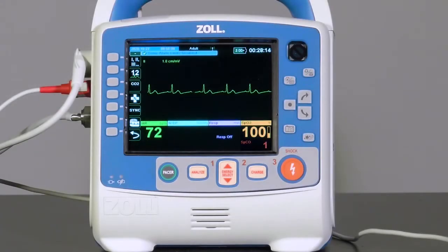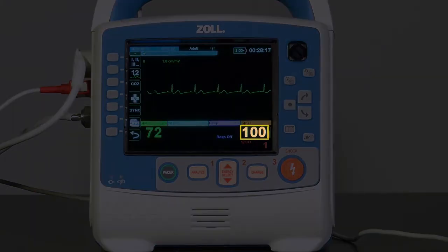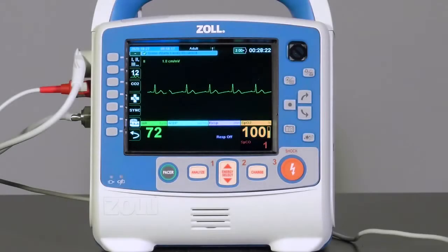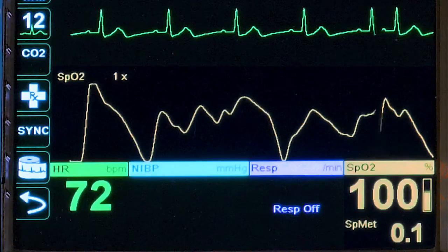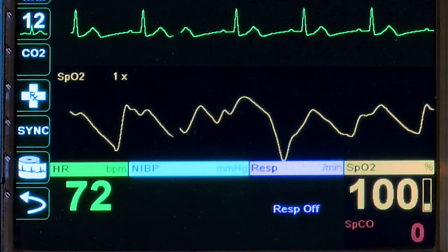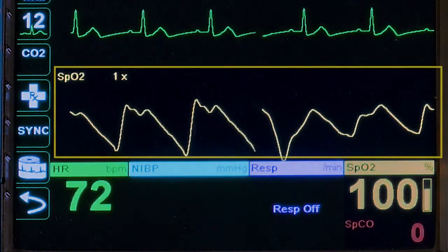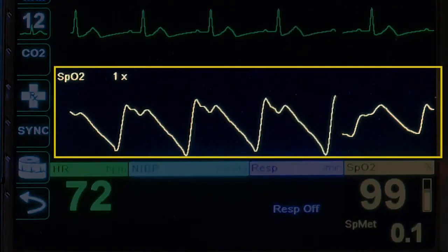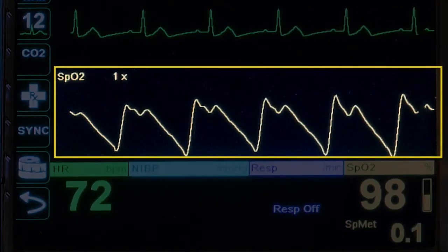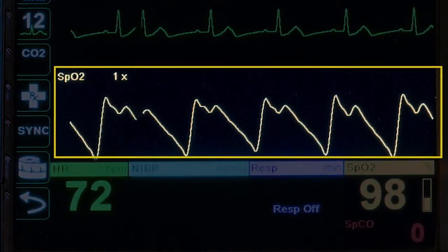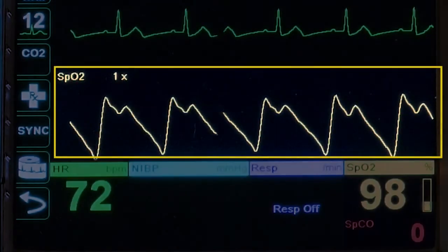After a brief delay, the unit displays the pulse oximetry measurement as the large number in the upper portion of the SpO2 window. As the initial measurement is being displayed, the plethysmograph waveform will automatically display on the screen.